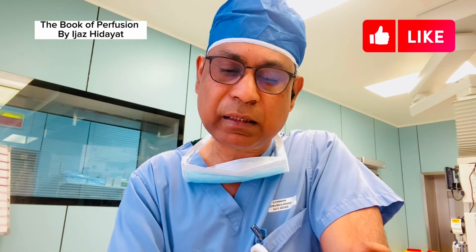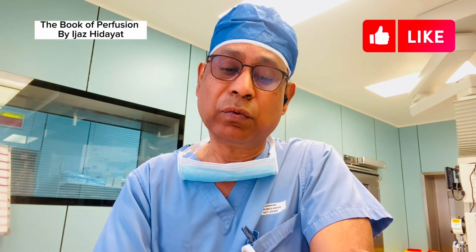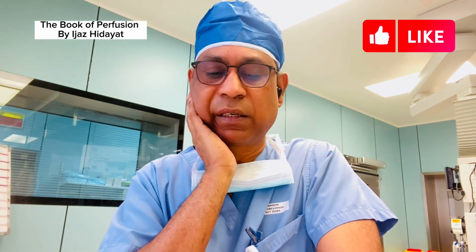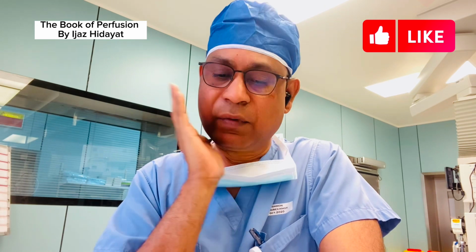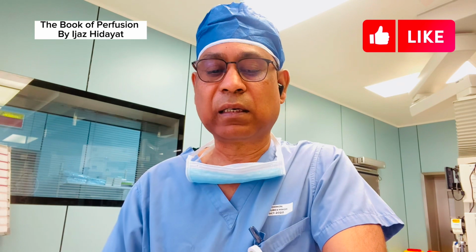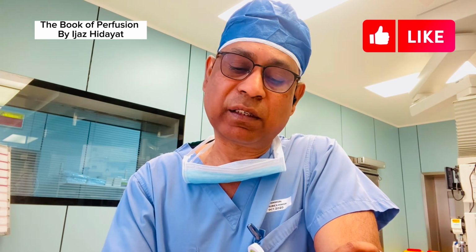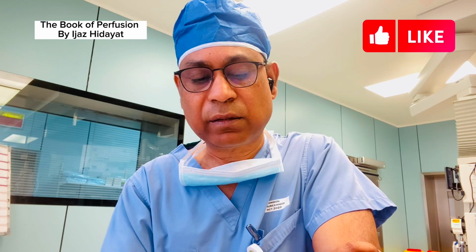required by the anesthetist. And once you wean off from bypass, do modified ultrafiltration for at least 10 minutes. We do modified ultrafiltration to remove the initial cytokines and excessive fluid which was emitted from the reperfused lung allografts and from the heart. Once your modified ultrafiltration is completed, you can remove your venous and arterial cannulas.